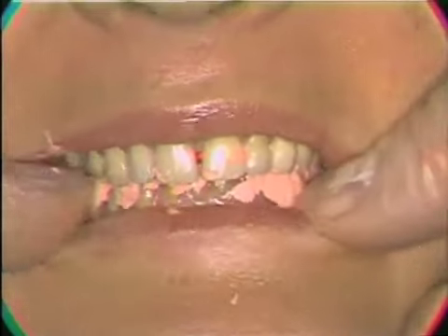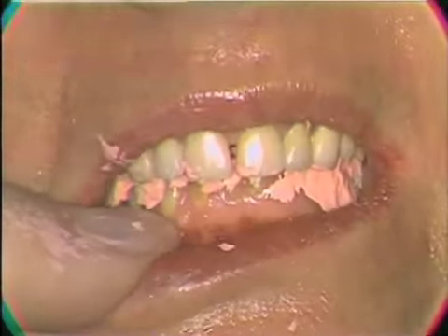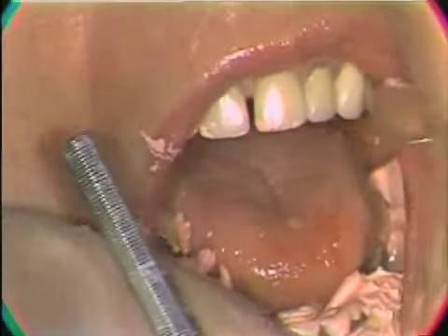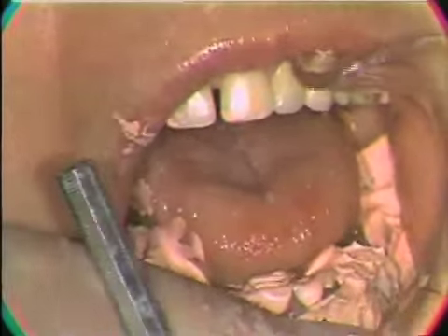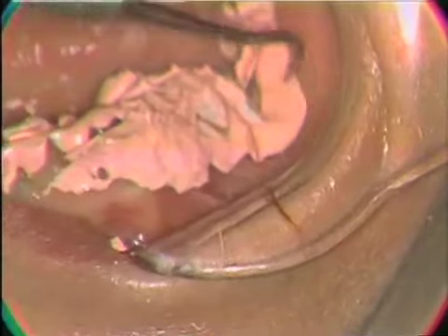After the material has reached its initial set, it's well to go in there and examine the peripheral areas that you can see and see if they're okay. Open, please. Now roll your head this way just a little bit, please. This area here, tip your head down just a little bit. Examine the peripheral areas as you see here to make sure you got a good peripheral roll on that.